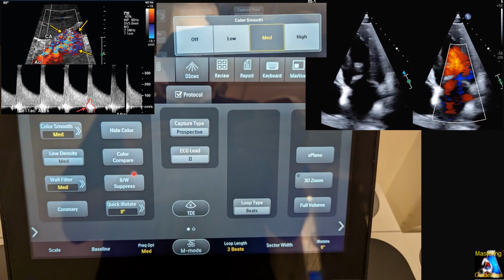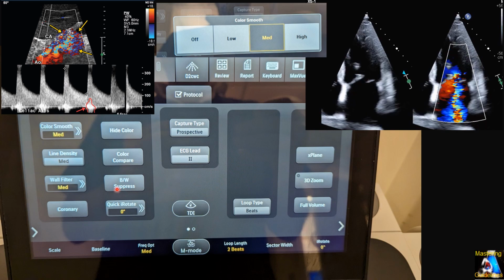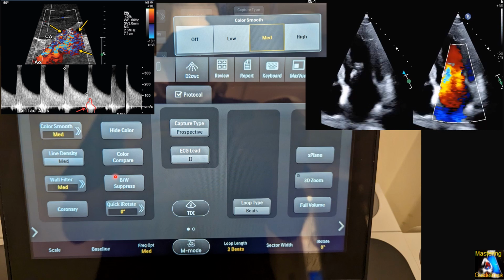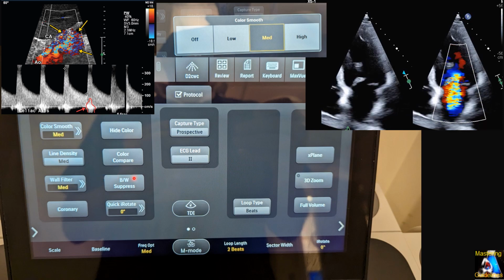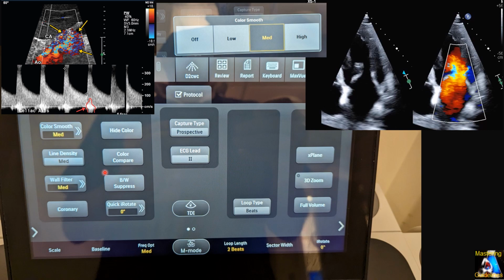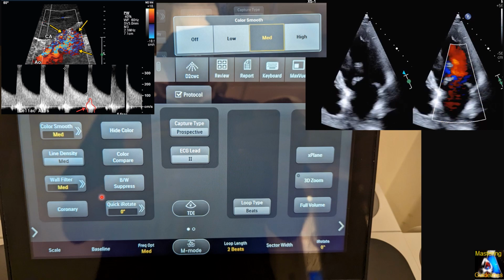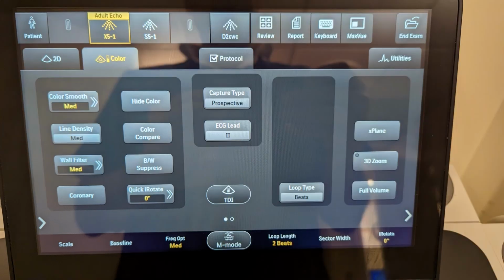In those cases, we just have to keep our transducer stable, and if this is a result of breathing, the patient holds his or her breath, or we scan in a different spot that doesn't have that movement of the intestine, or just give it time until those movements disappear. Another option is the frequency of our sound beam.